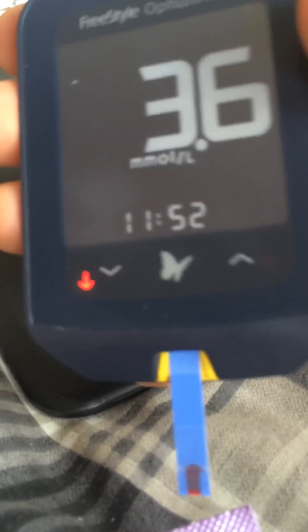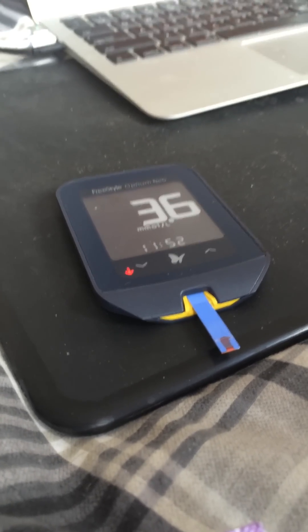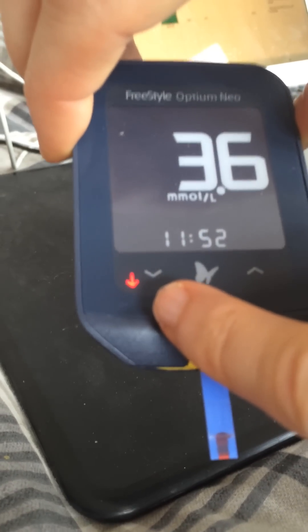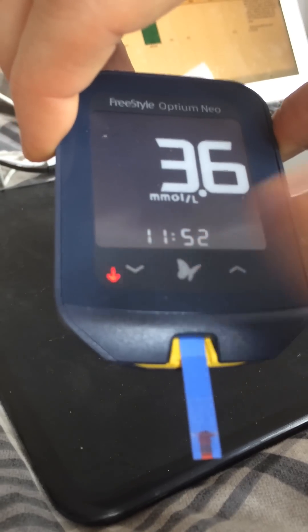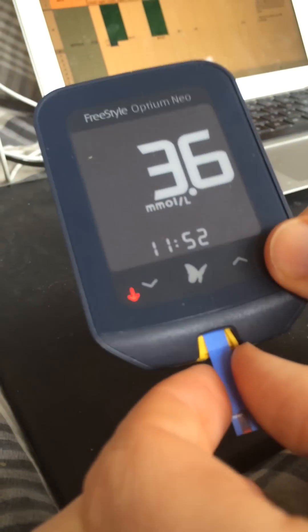Right now my blood glucose is 3.6. This little red marker is showing that it's too low. But of course I've been fasting for nearly 4 days now, so mine is really low because my ketones are really high. I've become more of a ketone burner than a glucose burner due to my fasting state, so you don't have to worry about this. When you've finished, you just pull it out and it resets the device, and we're ready to do the ketone.